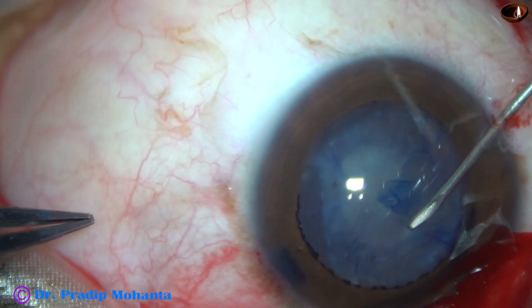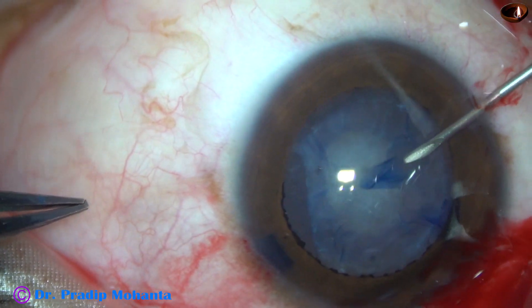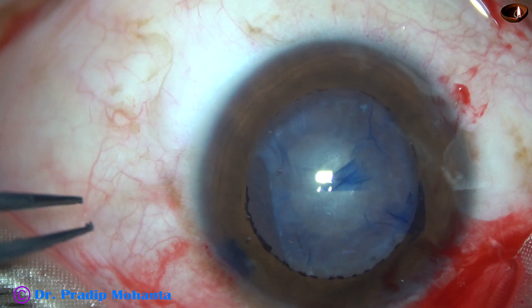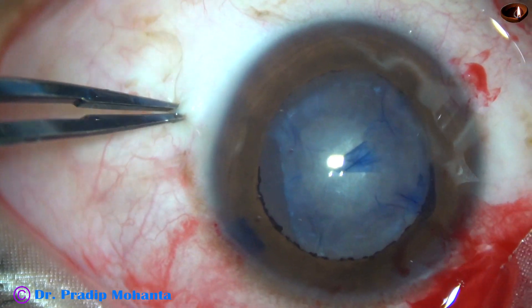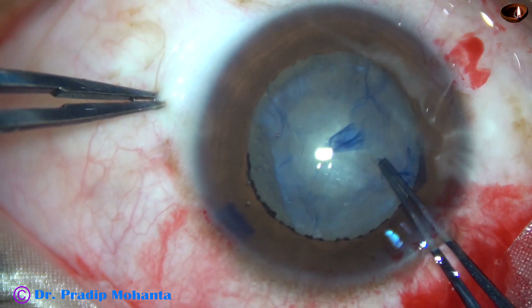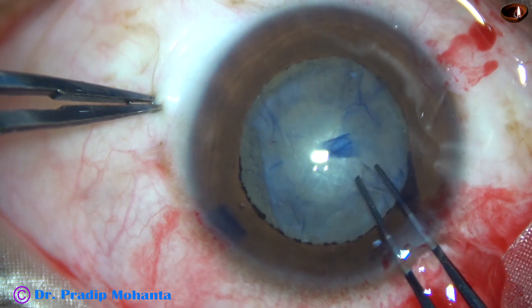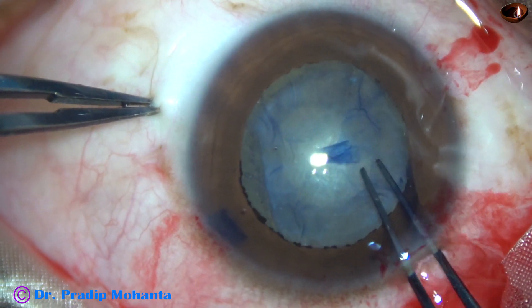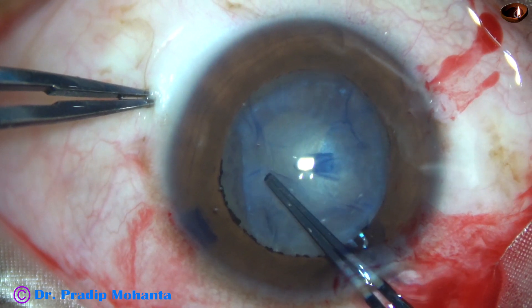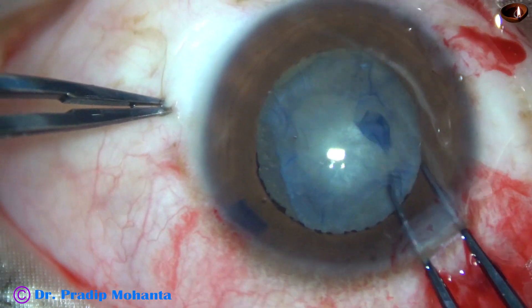Here the capsule is firmly adherent in some places to the underlying fibrous tissue, so I cannot do a clean rexis. I did manage this — I've got a large opening here.